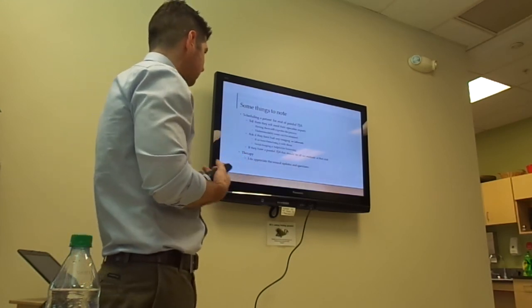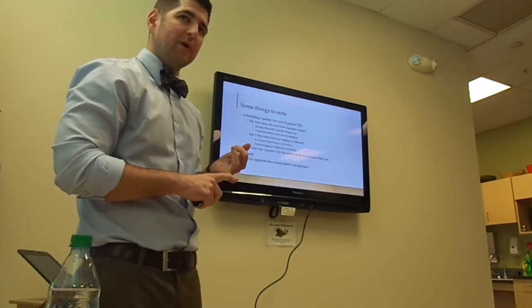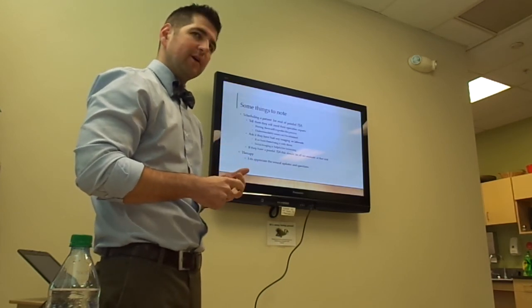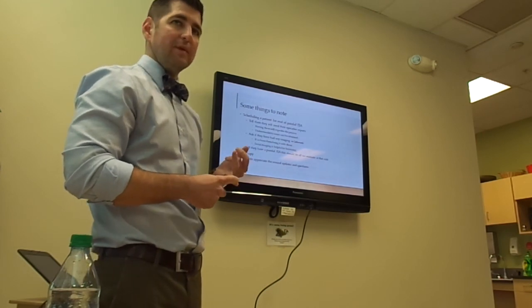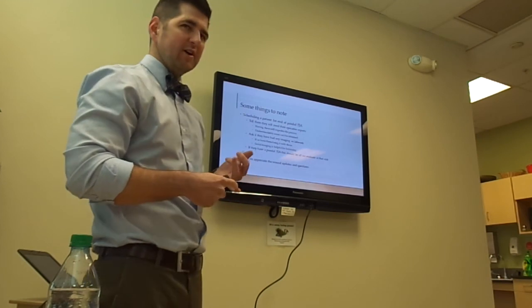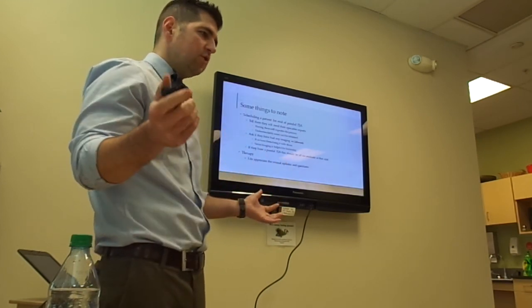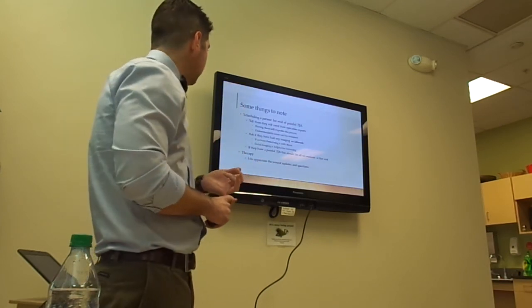Whenever they call to schedule, see if they can get their operative reports, because if we have to do a revision, it's good to know what kind of implants they have in, and what size. That takes some of the questioning out during surgery at the hospital, and allows them to maybe have less equipment there if we need to. Some vendors might have a hard time telling between the first or second generation of their implants, so they might have to have two whole different types of implants there if we don't have the operative report.